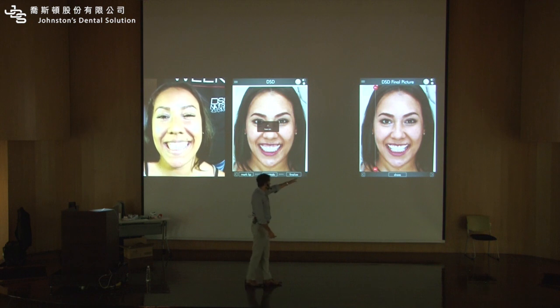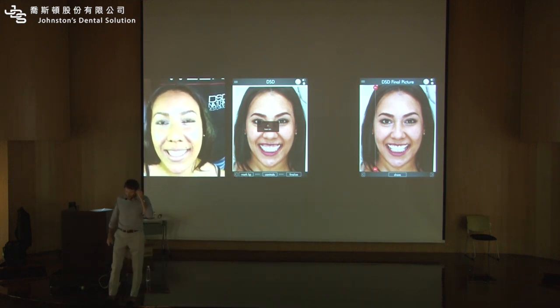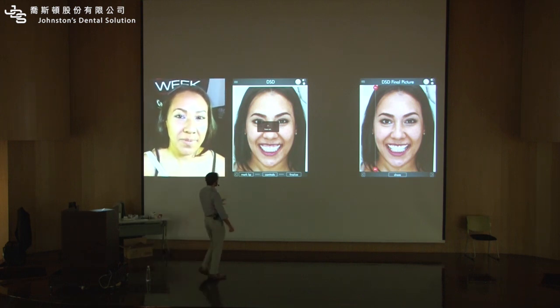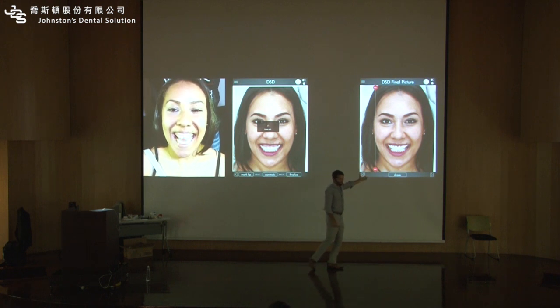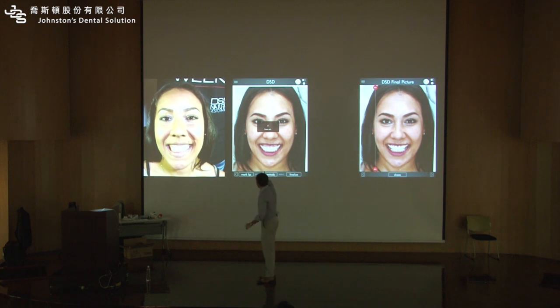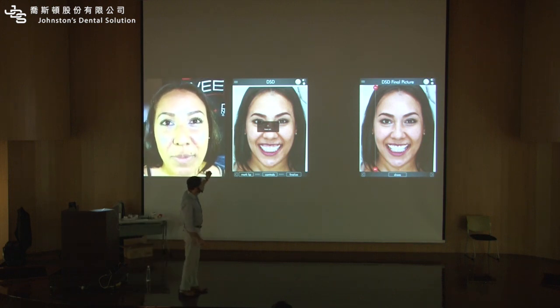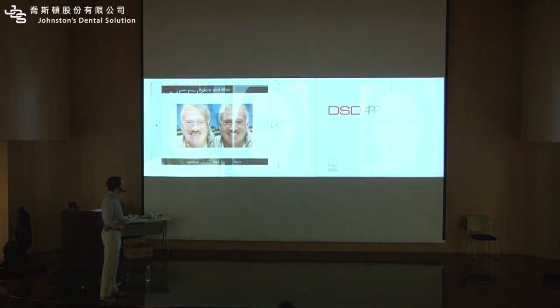And then here you show. So you can show both simulations when you're explaining the treatment plan to the patient. Okay? Now, she decided she wanted to test this solution before thinking about orthognathic. Of course, this is a very aggressive surgery. So the patient is like, can I do a mock-up like this to see if it's good enough? Say yes. So this file goes to the planning center, and I order a mock-up from the planning center.